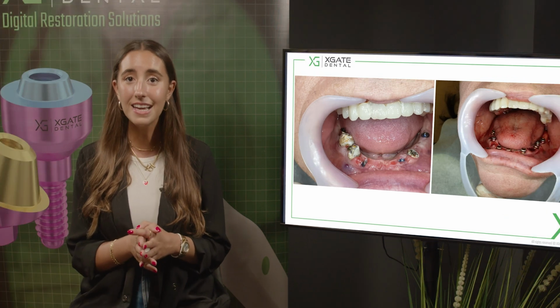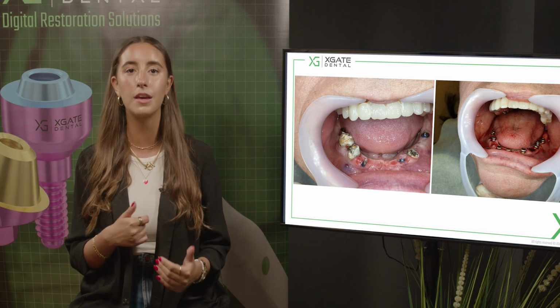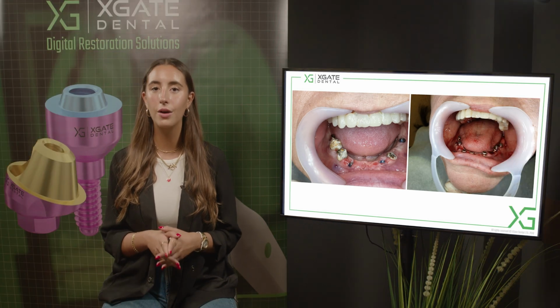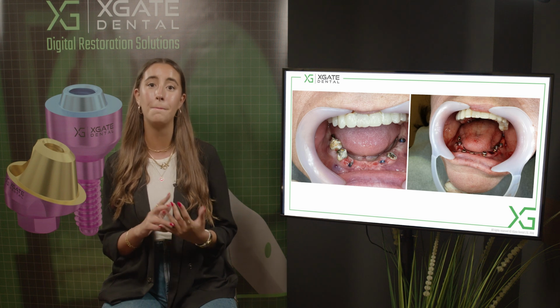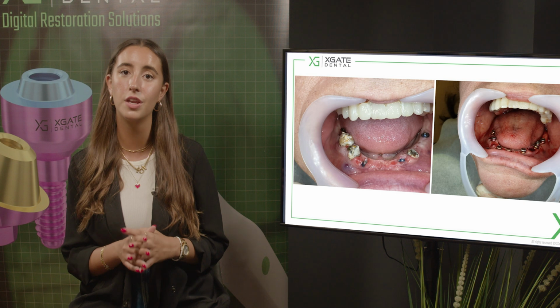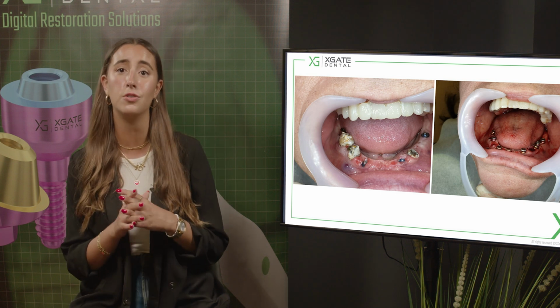In the second stage, we added some implants around the extraction, and you can see that one of the implants is angulated because of the mental nerve. We want to go around the mental nerve so that the implant has a mesial angulation. And we know that in this implant, we have an angulated multi-unit that will correct the angulation of the implant like in the classical All-on-4.